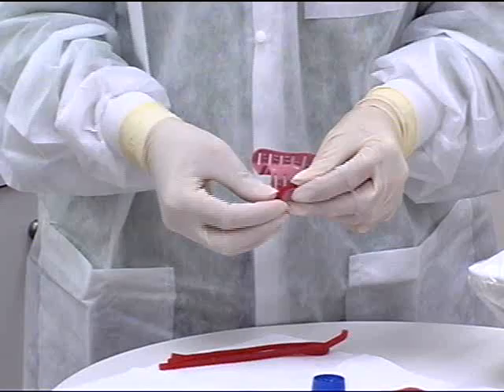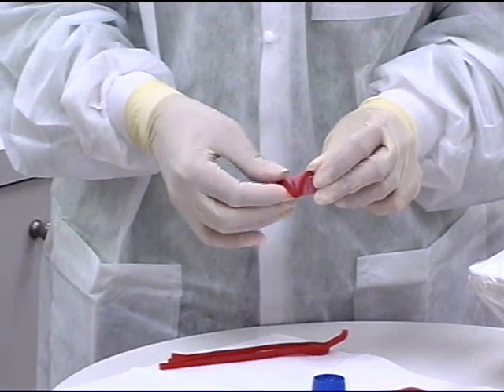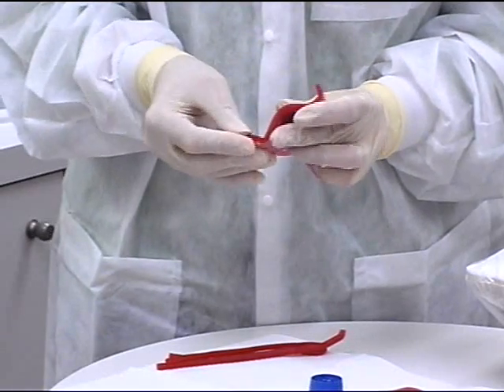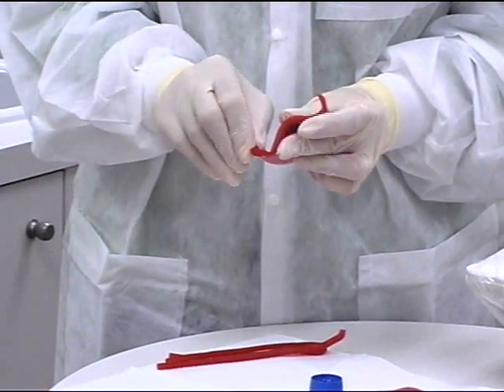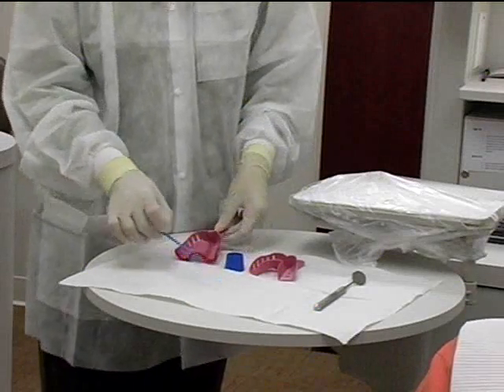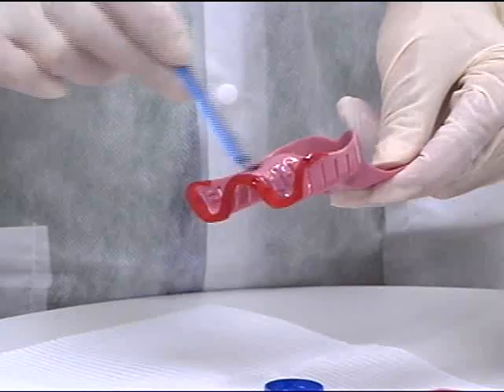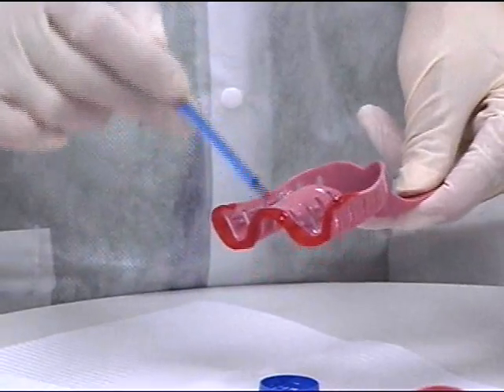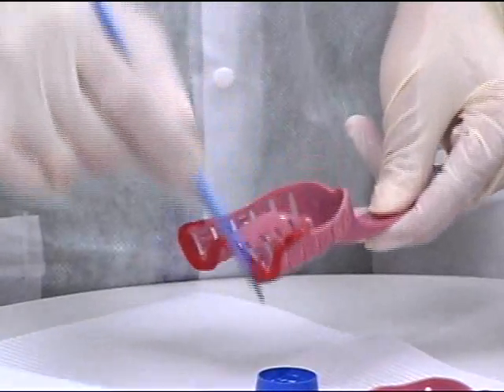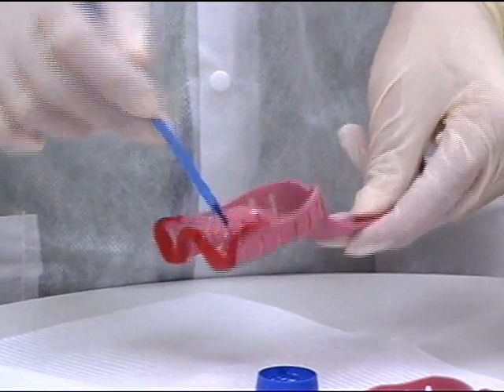Trays may be modified using rope wax or modeling compound to ensure that any extension of the alginate is well supported. The goal is to avoid unsupported alginate impression material. Apply tray adhesive to the impression tray to ensure that the alginate will not pull away from the tray upon removal from the patient's mouth. Allow the adhesive to dry for 3 to 5 minutes.